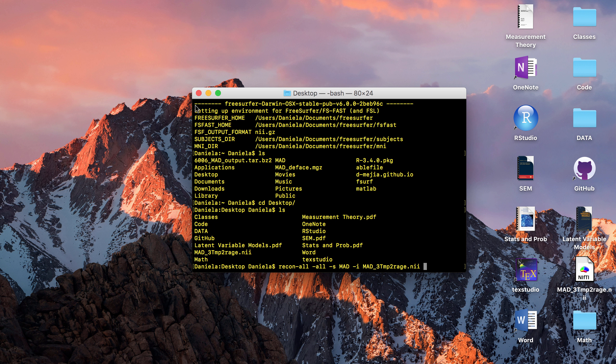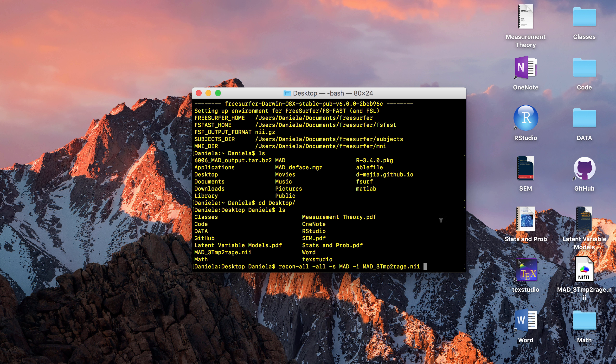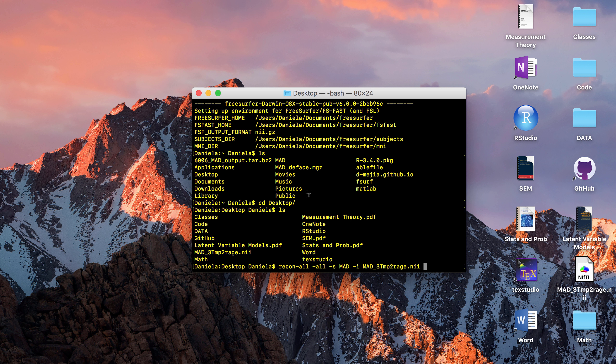Then we're going to do recon-all. The -all flag says to do the full reconstruction, all the steps. You need the -s flag for the name of your subjects folder. I just label it like that, and then you need -i for the input file. This is where you're going to write the name of your NIFTI. That's all the flags that you need. You can play around with adding additional flags if you're familiar with FreeSurfer, or if not, that will start running.